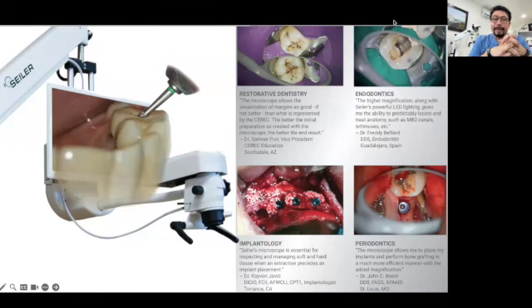But the problem is when you have to work in different directions and with different angulations of the microscope. With the regular microscope, that is more difficult than with the 3D microscope, because with the 3D microscope, as we will see, you have freedom of movement because you can angulate the optical pod in any direction, and you will have direct vision in most of the clinical situations.